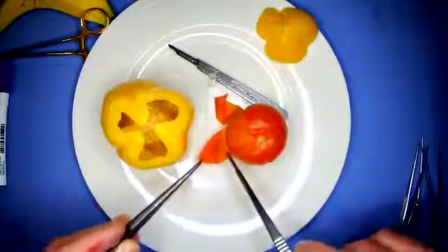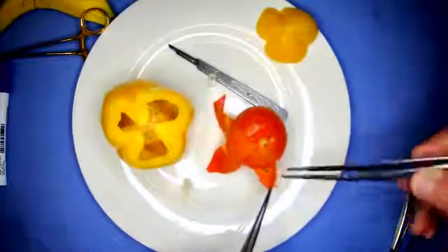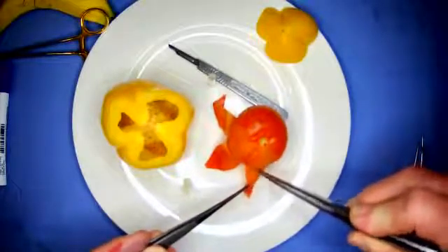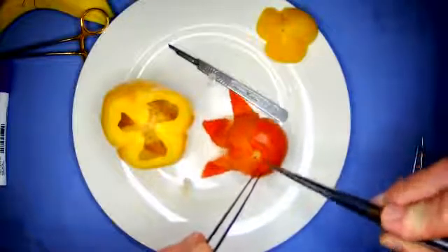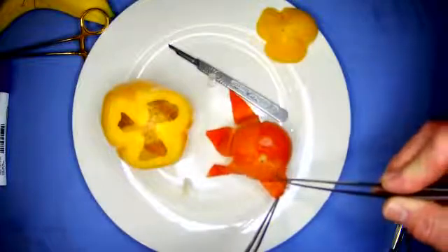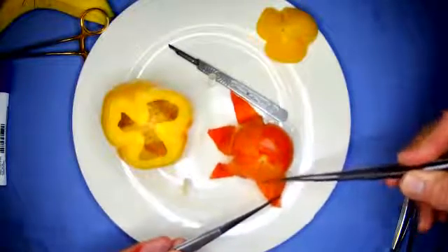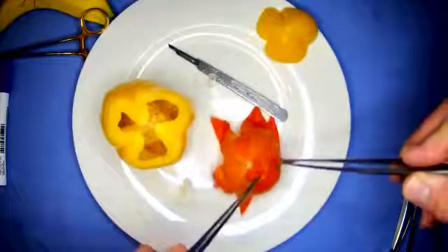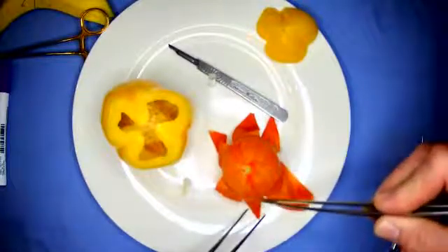That's pretty easy, but it is boiled. If you grab it incorrectly, you can tear it, pull it down. So I'm using two forceps as one. I can use it to gently brush something off the surface as a blunt dissection instrument rather than poking, and remove. There you go. I can gently brush, use my forceps as well as gently teasing that off with my forceps. And all this is doing is again practicing not only the accuracy but the delicacy that is required. And you can do this with any other fruits as well.